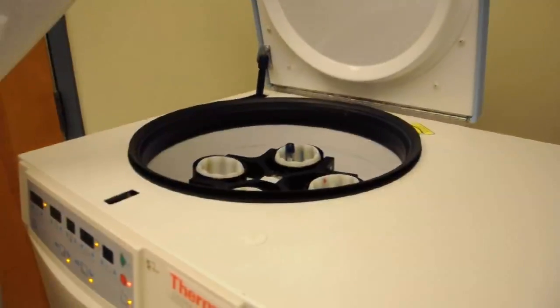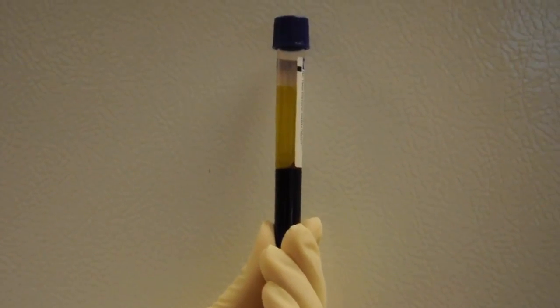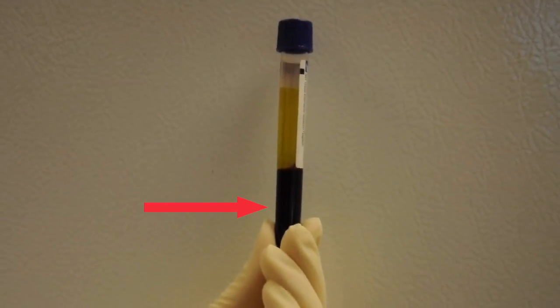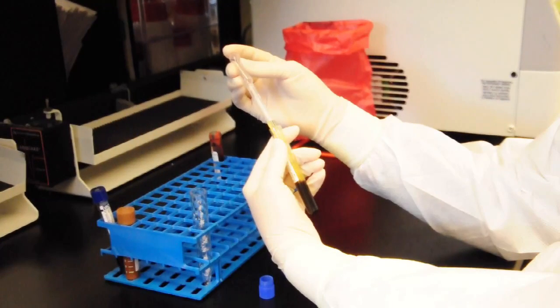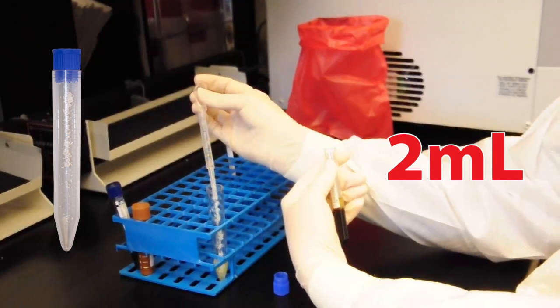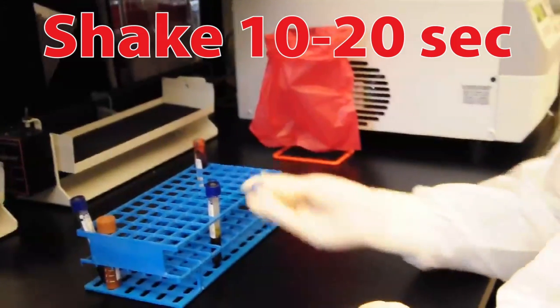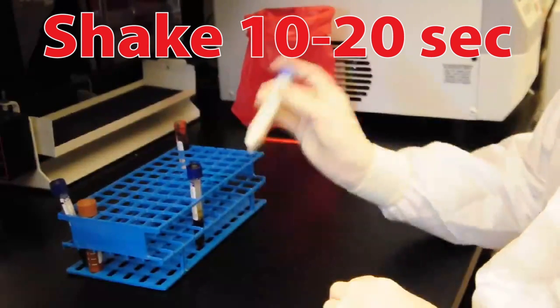Once the sodium heparin tube has finished spinning in the centrifuge, the blood should be separated into three parts: plasma, buffy coat, and red blood cells. Begin processing the blue top sodium heparin tube by pipetting and transferring all 2 milliliters of plasma into the blue top preservative tube. Immediately and vigorously shake the blue top preservative tube for at least 10-20 seconds until the sample turns chunky and white.